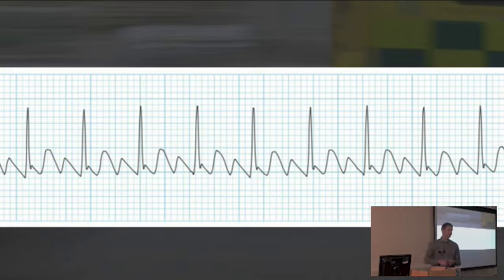You see, it's a 3-1 pattern, and that's going at about 100 beats per minute. But this is it. The atrial flutter has these characteristic sawtooth waves and a predictable pattern. When it's going at 150 beats per minute, if it's 2-1 block, it's sometimes quite hard to see these sawtooth waves because they're buried in the T waves.